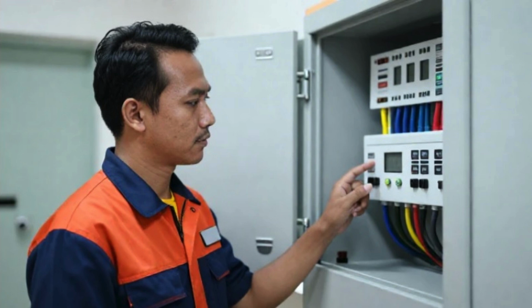In addition to grounding, electrical isolation is widely used in medical equipment. Isolation separates the electrical circuits inside the device from the patient and the power supply. This is often achieved using isolation transformers or opto-isolators. Isolation helps prevent dangerous currents from reaching the patient, even if a fault occurs inside the equipment. Many life support and monitoring devices rely heavily on isolation to maintain patient safety.